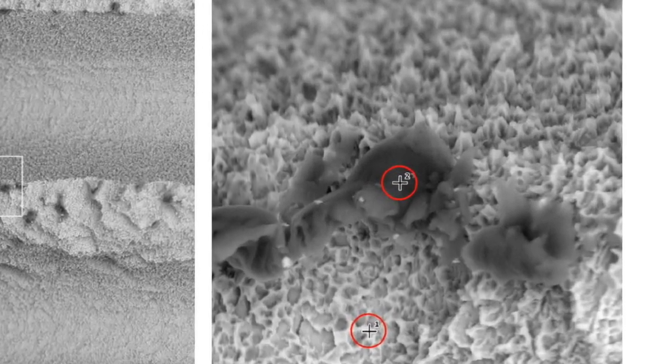I fear so. I've seen quite a few actually of the images you have produced from these implants. And in the beginning, I must admit, I was astonished that they could sell some of those implants to customers. And I fear that this may be one of the reasons that we have overlooked in the past, that implant impurities that haven't been cleaned away can pose a problem. We don't know precisely today. We don't have any precise levels of what the human beings can tolerate or not.